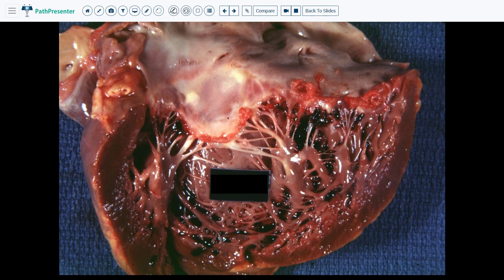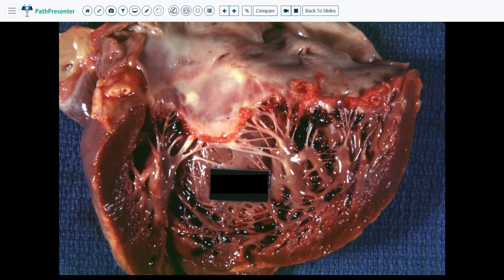Case 5 is non-bacterial thrombotic endocarditis. This area up here is the left atrium — you can see it is quite smooth. The cut edges of the left ventricle are here, and this is the mitral valve. You can see the edge of the mitral valve has small vegetations at the line of closure. This appearance is characteristic of non-bacterial thrombotic endocarditis.